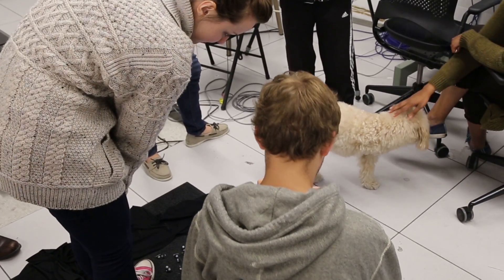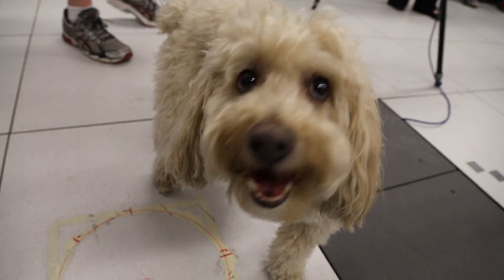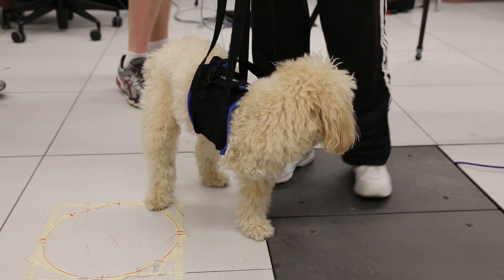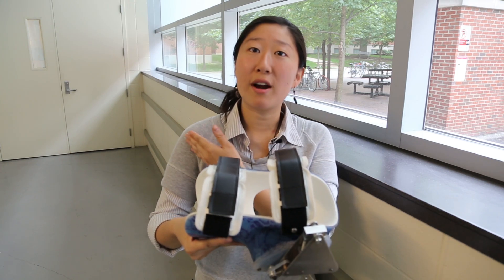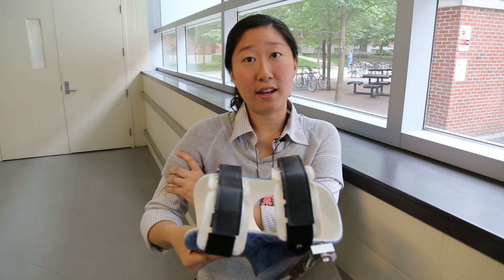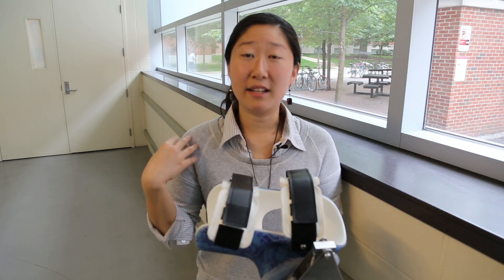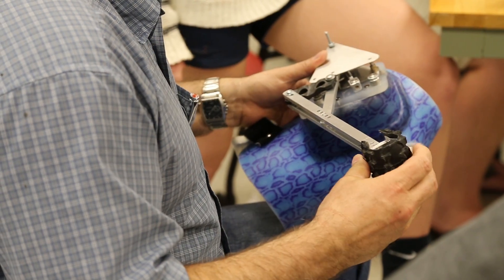I've always loved dogs and the opportunity to work with a dog for my senior engineering design project sounded like a great way to interact with dogs as well as improve the quality of life of Jimmy. Dogs amputated at the shoulder joint don't have the opportunity to have a prosthetic made for them, because most prosthetics require a portion of the limb segment remaining in order to attach a brace. Unfortunately, Jimmy doesn't have a remaining limb segment, so we decided to make a harness for him so that he can walk on four legs.